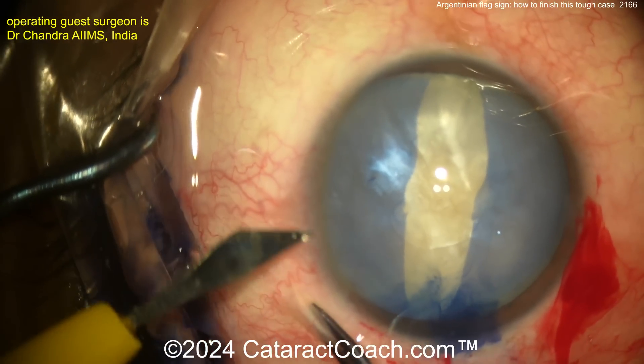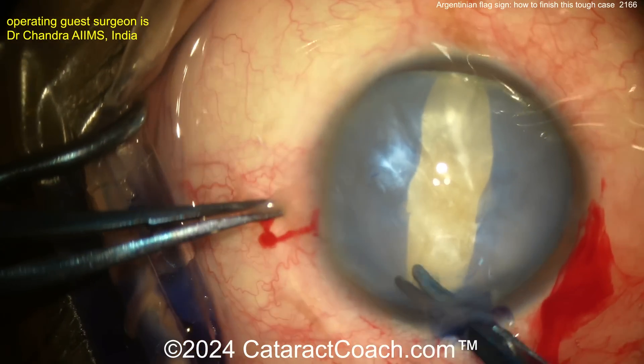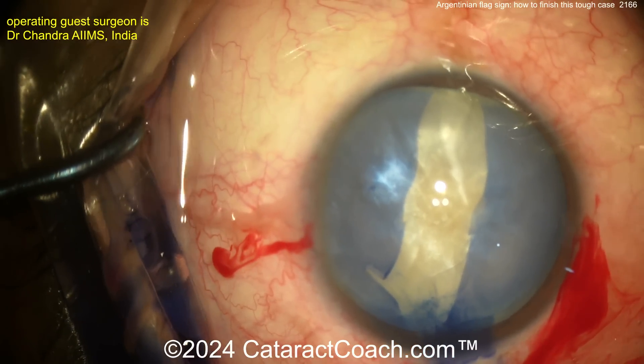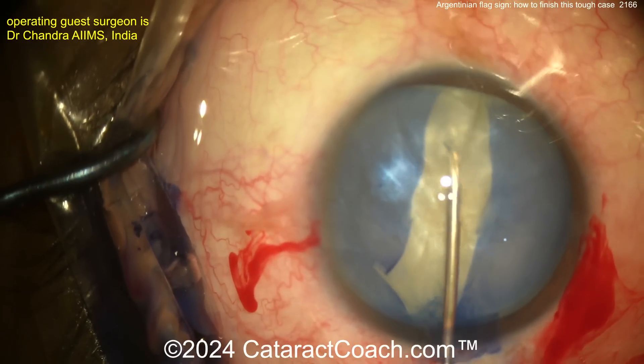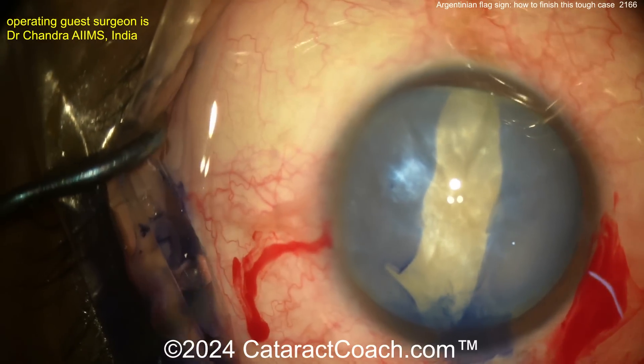That nucleus was coming forwards. As you try to poke into the lens capsule, that posterior pressure of the lens nucleus pushing forwards up against the backside of the anterior lens capsule just caused it to split. So now our surgeon made a nick here in the capsule, and is going to get a larger opening done here.